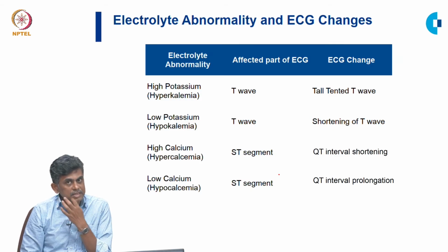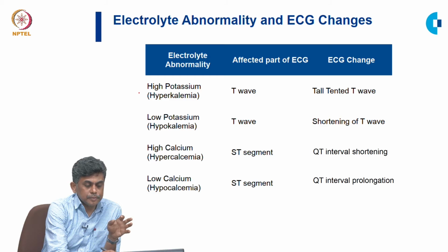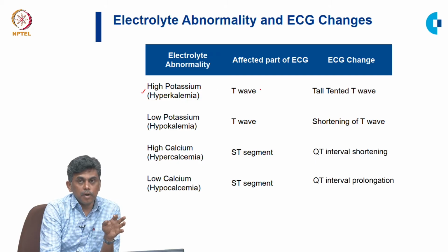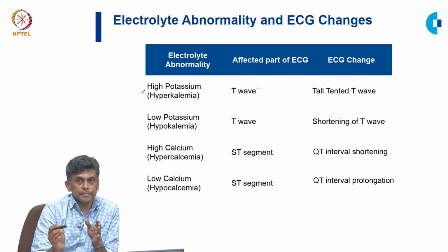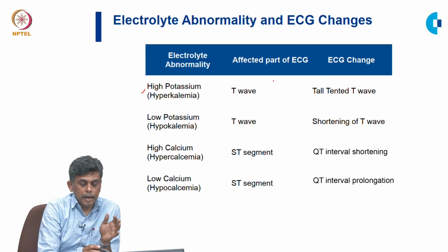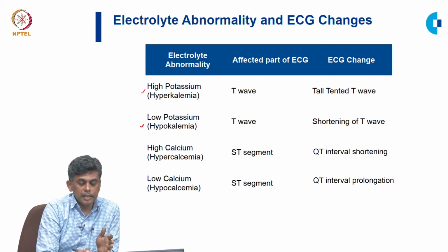First we will see about potassium. High potassium is called medically hyperkalemia, and now we know the phase involved in potassium will be phase 3. So, that is represented as the T wave, and low potassium is called hypokalemia, and that will also affect the T wave.